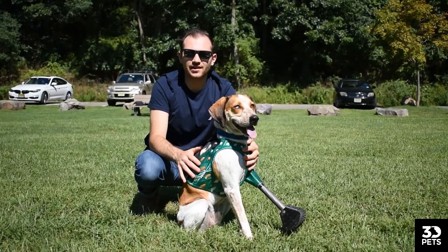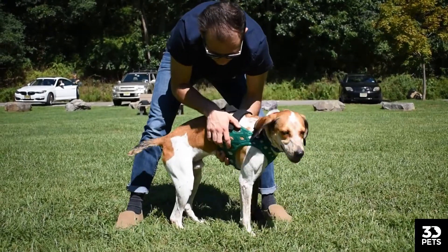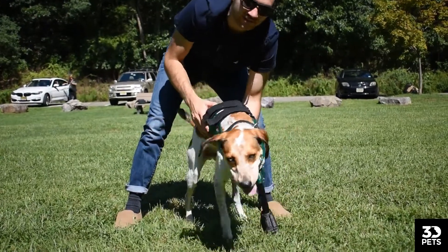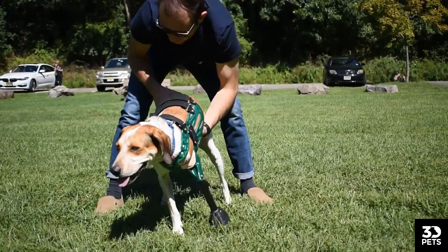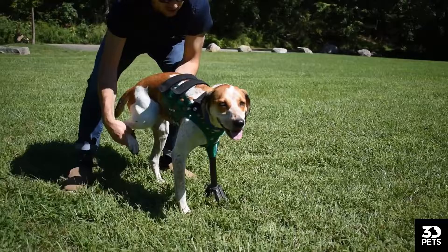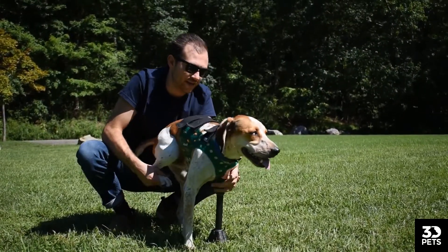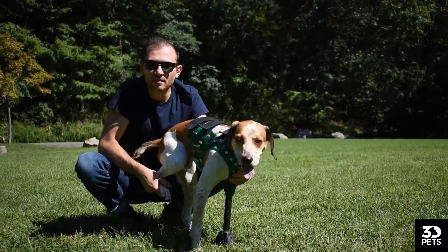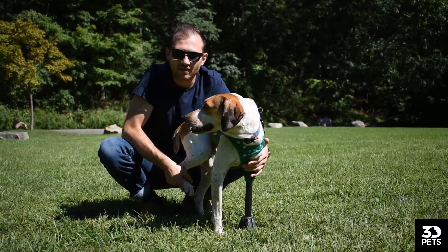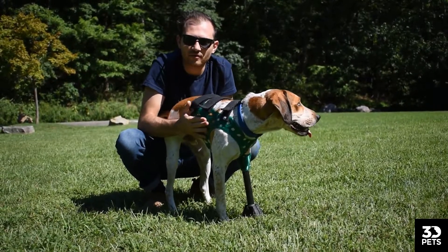One of the most important things you can do when you get one of these prosthetics is a little weight-bearing training. You want to stand your pup up — good boy Jack — and because Jack is a front left leg amputee, we want to lift up his back right leg. What this is going to do is force him to put weight on the prosthetic. You want to make sure that it's straight and that he can bear weight on it. This is going to really help him understand that he can put pressure on it. Do this for just a few minutes every day for the first few days.